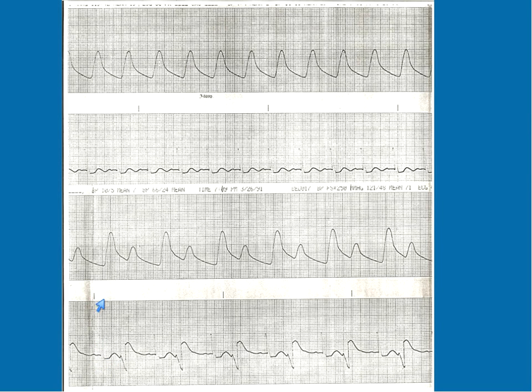Now let's look up. Look up what happens. There's the normal beat, and that's the blood pressure it produces. Here's the early beat. See how much the blood pressure dropped with that beat? This is the normal beat, and this is the early beat. This is the normal beat, this is the early beat. This here is the art line waveform, and the better blood pressure happens because the ventricle was fuller. The smaller blood pressure happens because the ventricle was not so full.